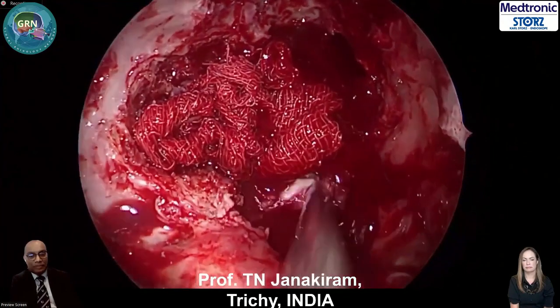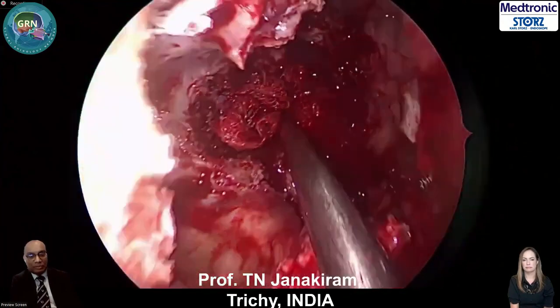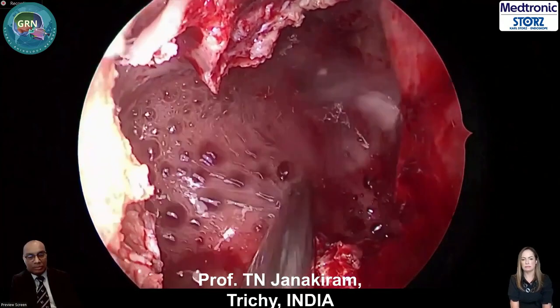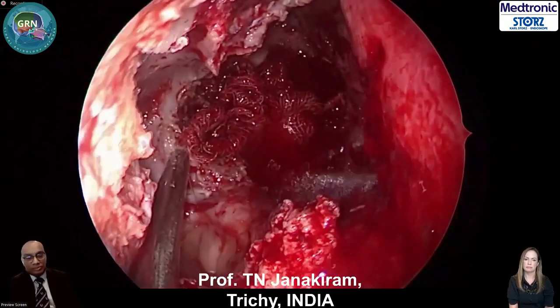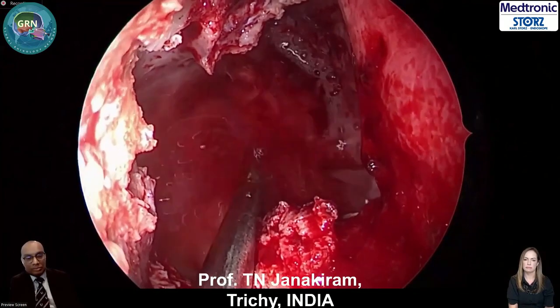Okay, now here we are. Give me good irrigations now. Now I'm just going to irrigate, keep irrigating fanatically. This is warm saline irrigation. Give me irrigations. Give good irrigations. Good irrigations, please. So the plan was exposure, exposure, exposure.